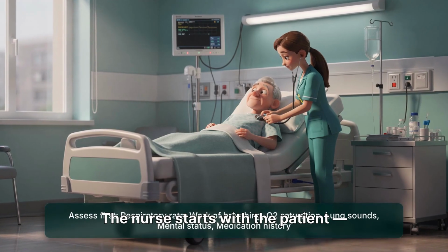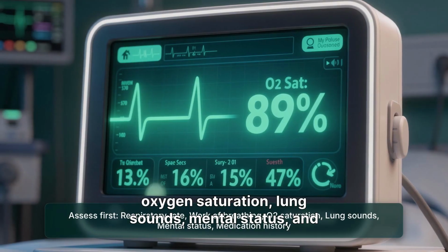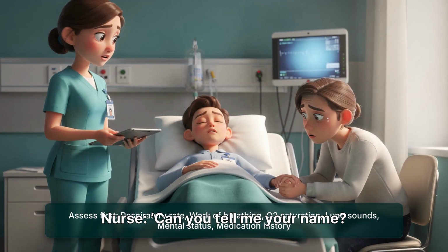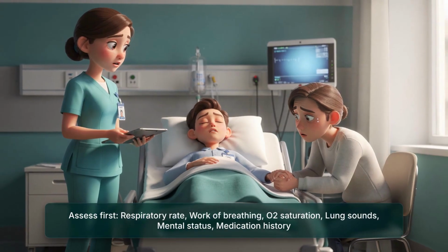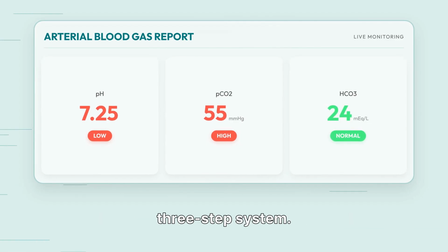The nurse starts with the patient, not just the numbers. She checks respiratory rate, work of breathing, oxygen saturation, lung sounds, mental status, and recent medication history. Nurse: Can you tell me your name? Are you having chest pain? Any new medications today? Any pain medicine or sedatives? The ABG comes back. Instead of guessing, the nurse follows the three-step system.